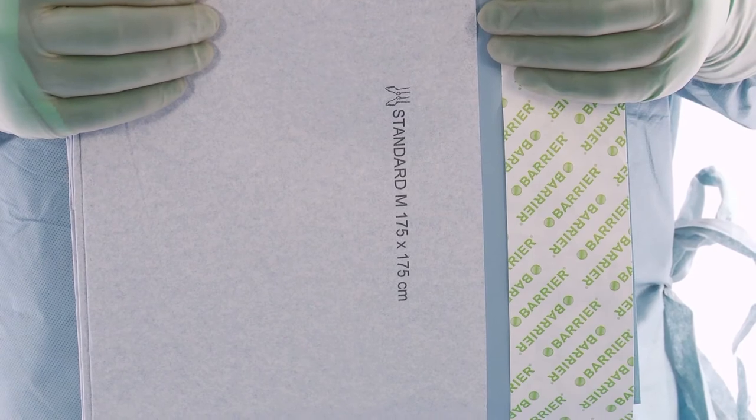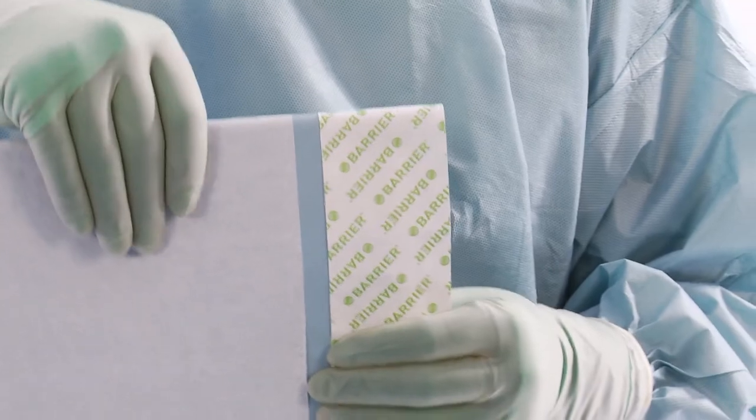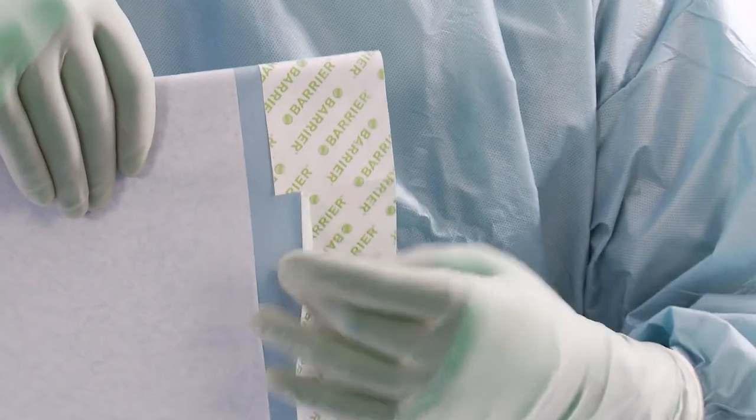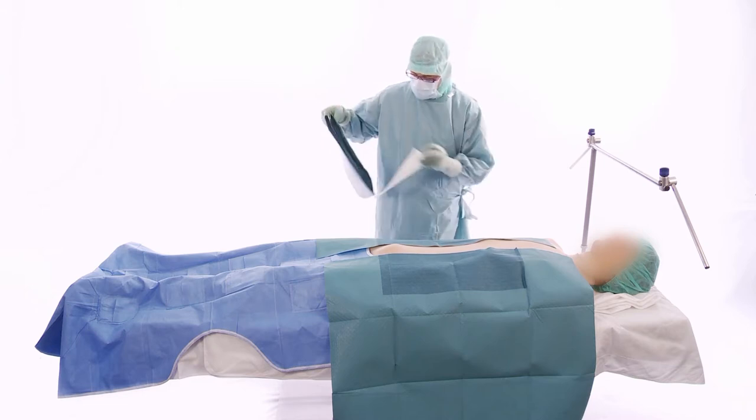Note the direction of the pictogram on the OP sheet. The OP sheet has three release papers for easy handling with perforation between the three. Remove the middle release paper first.